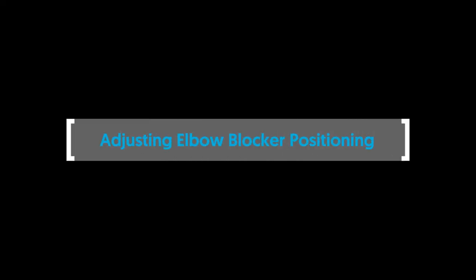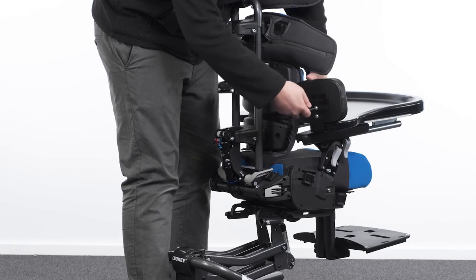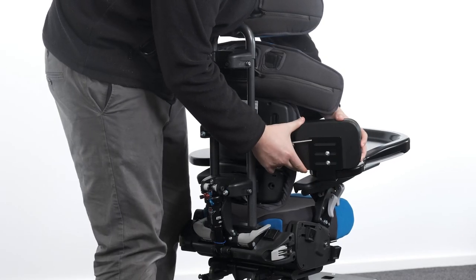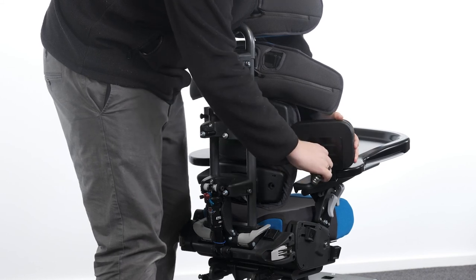Adjusting elbow blocker positioning. To adjust the elbow blocker, loosen the bolts and slide the pad along the slots into the desired position. Tighten the bolts to secure in place.